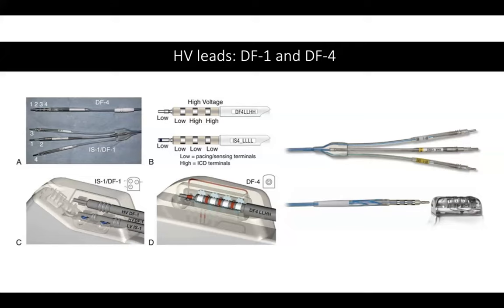Can I land with my comments? What I am asking is this. I have checked, because here we use Medtronic and now we are adding St. Jude to Medtronic. When I check this, the port that the stylet usually goes to is the middle, and it is always written IS1, and that is where the stylet goes through. And on the battery we have a round sign with a dot on it, while the others have a round sign without a dot. I've checked both St. Jude and Medtronic, so I want you to explain that.